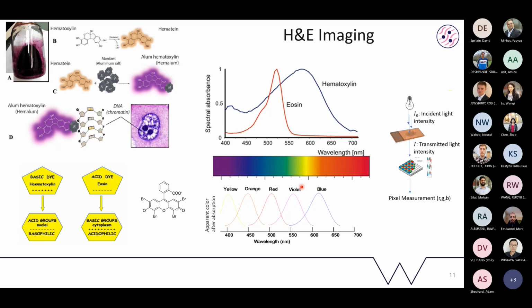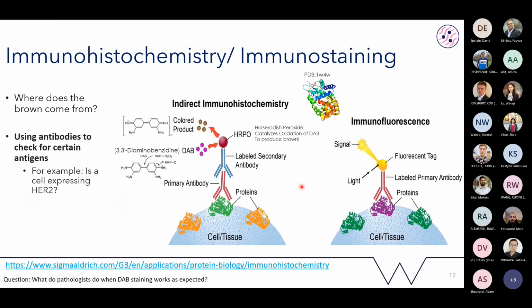You all know that, right? So similarly, this can tell us to some extent how much DNA is being expressed, but it doesn't do a very good job for binding to different proteins. So it has its limitations that I think Adam or Mark is going to talk about.